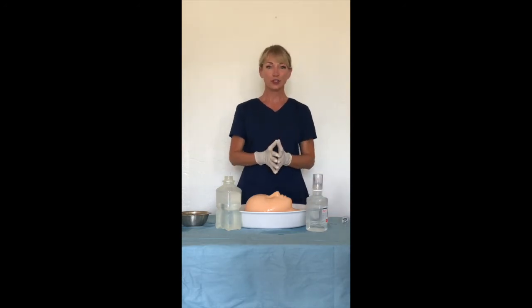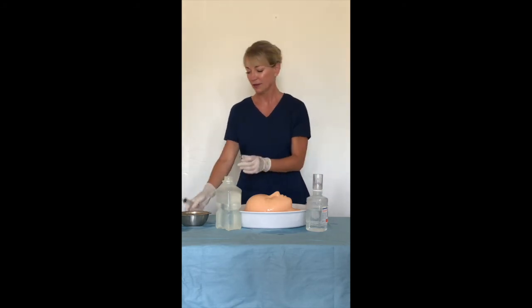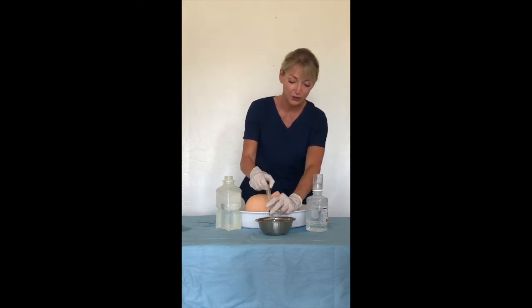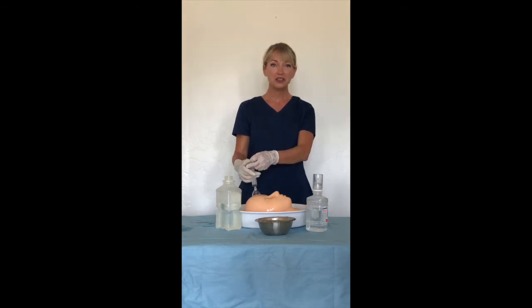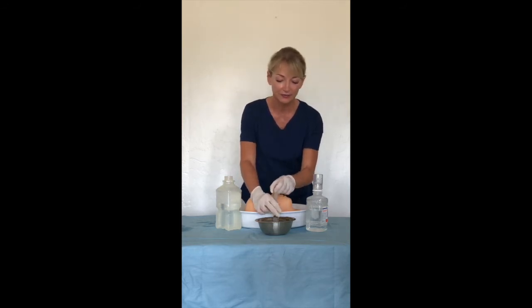Now I'm going to demonstrate irrigating a wound with an irrigation shield and a syringe. So the first thing you need to do is fill the syringe and then attach the shield, and now deliver the fluid to the wound. That took about 15 seconds to deliver 20 milliliters of fluid. So let's try that again.